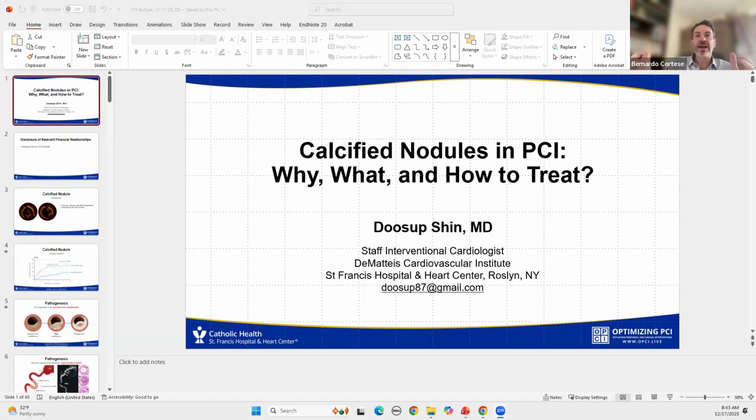I did IVL, though it was an eruptive calcified nodule, but there was no way to expand it well. And then I put another stent. And in the last 2 months, the patient didn't come back. So this is to say that, one, it's very difficult to deal with. Two, it may change with time. And three, it's difficult to categorize eruptive or non-eruptive, because even an eruptive one can be difficult to expand well, since probably it was non-eruptive prior.